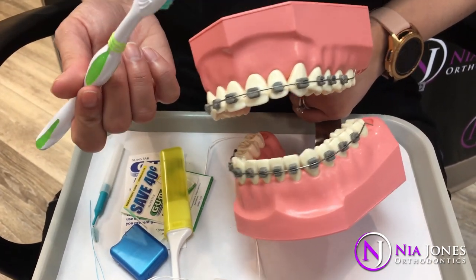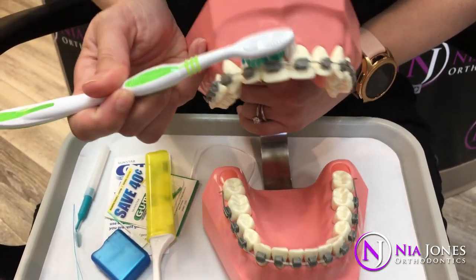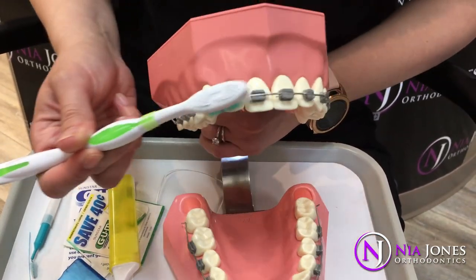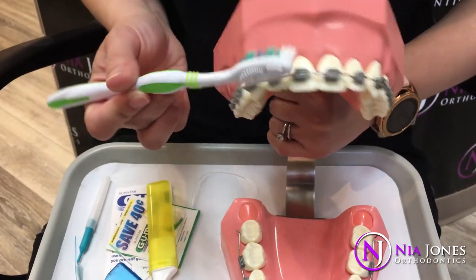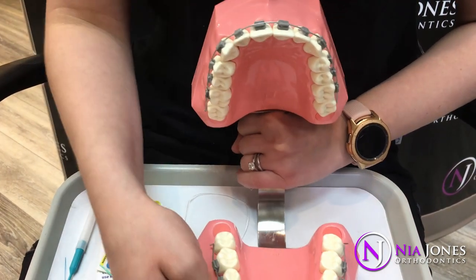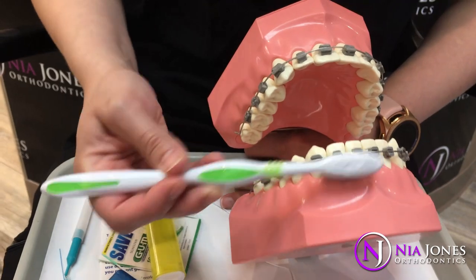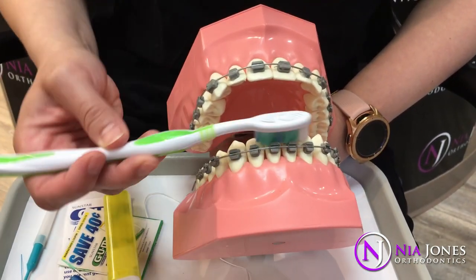When you're brushing your top teeth, you want to make sure you massage all along the gums — so you get your gums, the tops of your teeth, and the tops of the braces across the front and then up. Same when you're brushing your lower teeth — you want to make sure you get all along those gums, across the front, and then down.